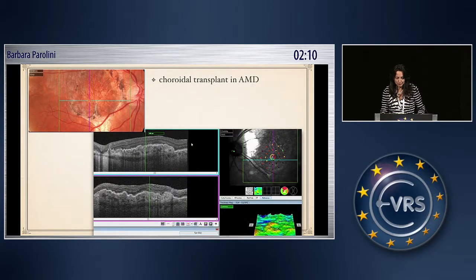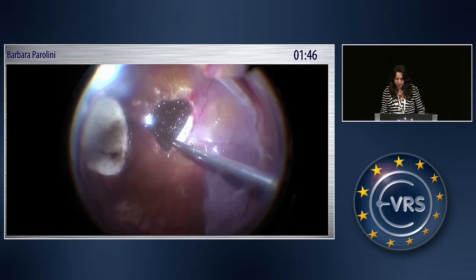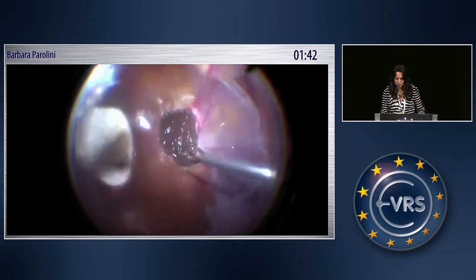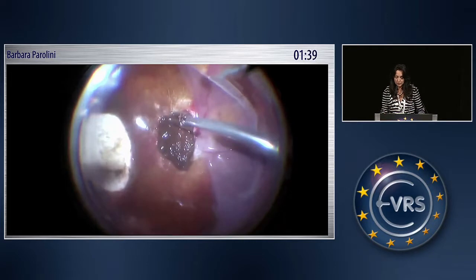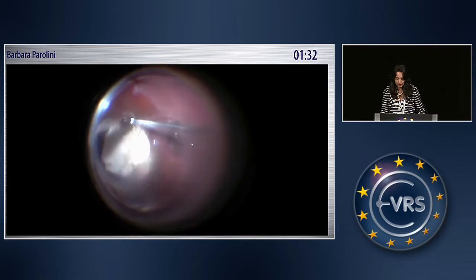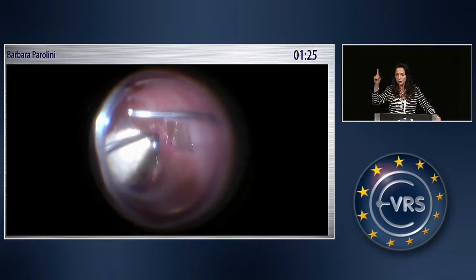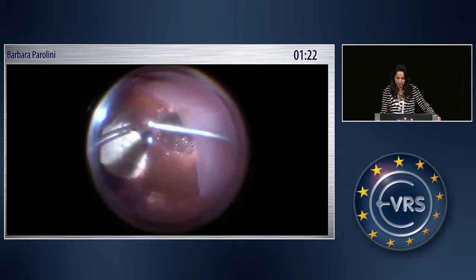So I wanted to apply the choroidal transplantation and retinal transplantation simultaneously to cases that I would not operate with choroidal transplantation itself. So this is a case that is not indicated. If you do only choroidal transplantation, you will not obtain anything because the retina itself is atrophic. I tried the simultaneous transplantation of the patch of choroid and the patch of retina harvested from the very periphery. Let me tell you, I didn't know how to do it. So I started by placing a patch of retina on top of the patch of choroid. It is described that you can obtain extrafoveal new connections. That's why I decided to do that.